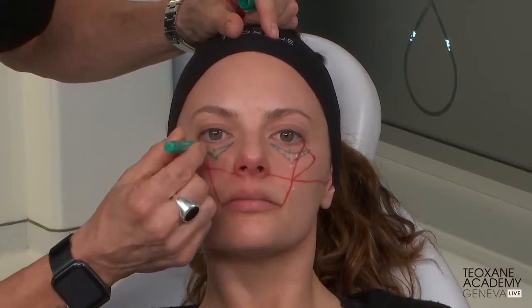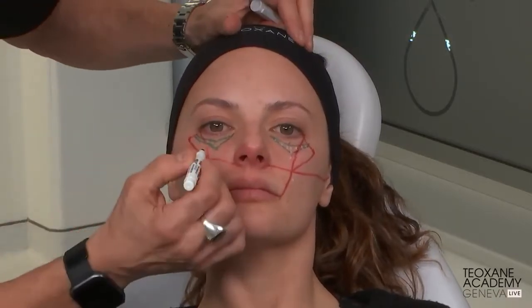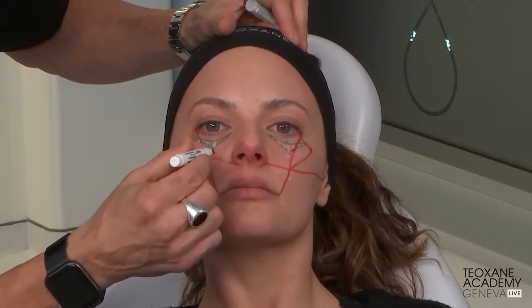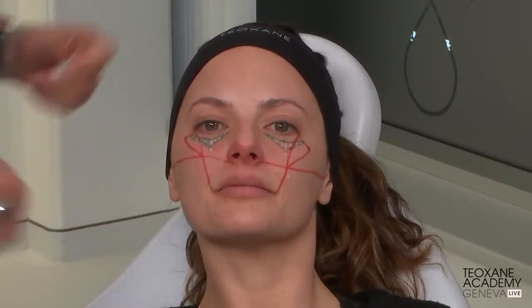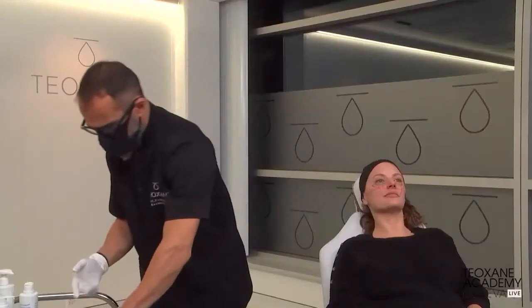And this is the patient being prepared. Finally, I prepare my points of treatment: lateral, central, on the rim, at the apex and just below, and medial. Three points right there. So this is my entry point. Now I put my sterile gloves on. The patient was already prepped, so I need to quickly re-prep the patient only.